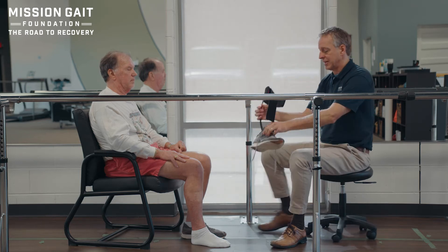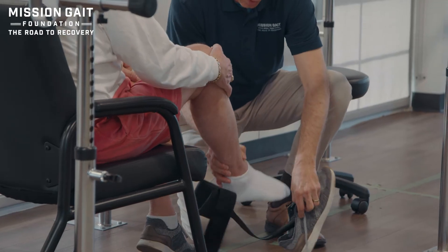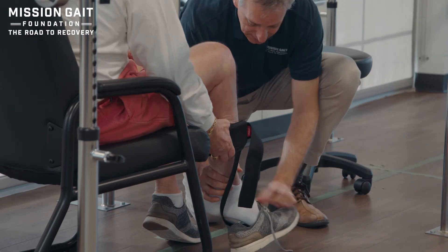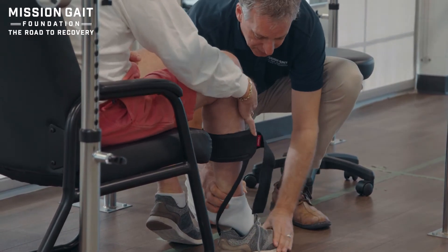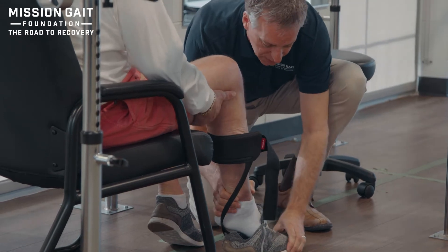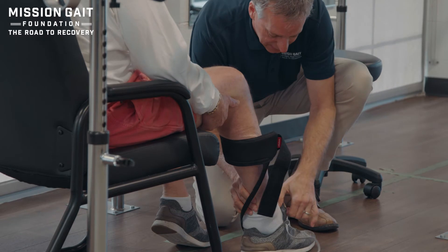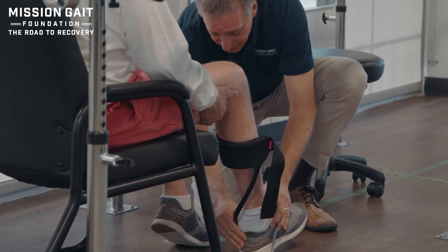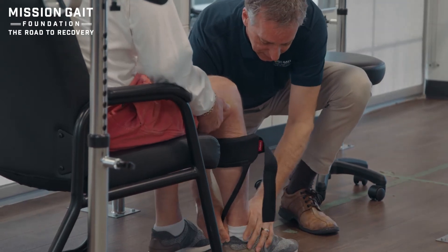From here, we're going to put this into position, pick that foot up, bring it in front of the brace, and slide down in. You've got to remember that those toes may want to curl up, so take your time and make sure you don't force the foot in. Give that foot a little bit of time to slide down in, keep pulling the tongue up until you feel that device slide past. Just straight down in - nice and easy.